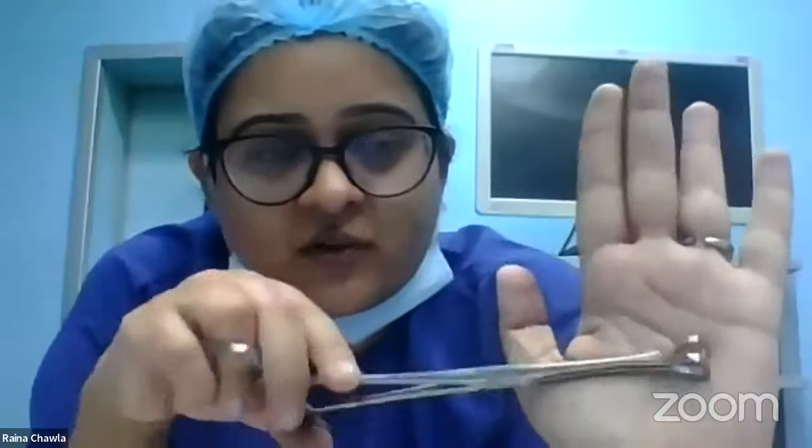Other places where we use this: holding lymph nodes, say in a retroperitoneal lymph node dissection. In surgery, in an appendicectomy to hold the appendix, or holding the ureters, or the margins of the bladder. Surgical uses are more than in obs and gynae. We basically use it to hold the fallopian tubes and in lymph node dissection. You can see it is atraumatic. The fallopian tube, if you hold it, will basically come inside here. It has no teeth, and yes, it is an atraumatic instrument.